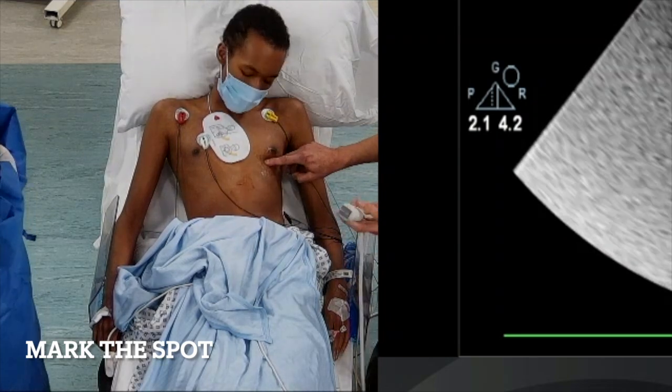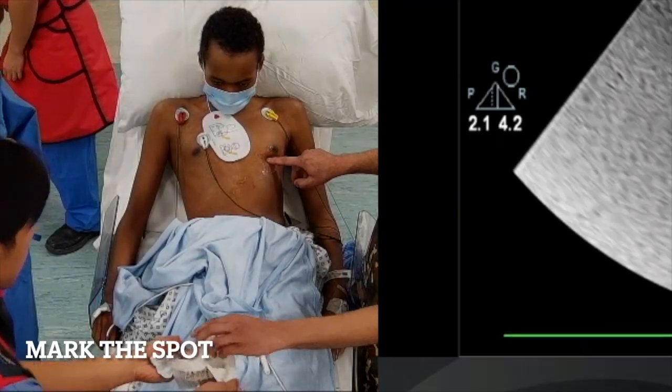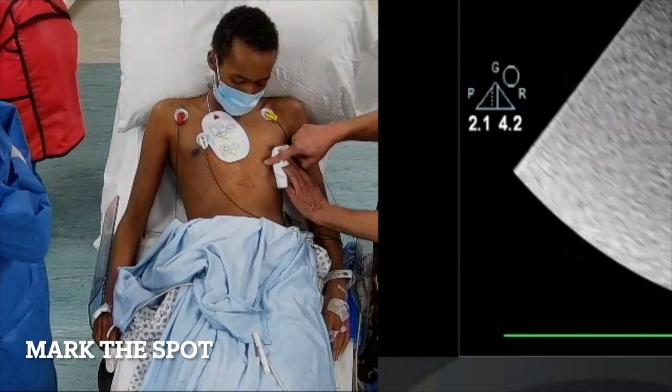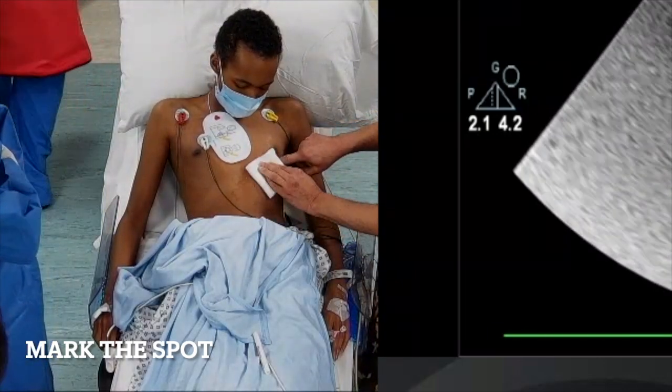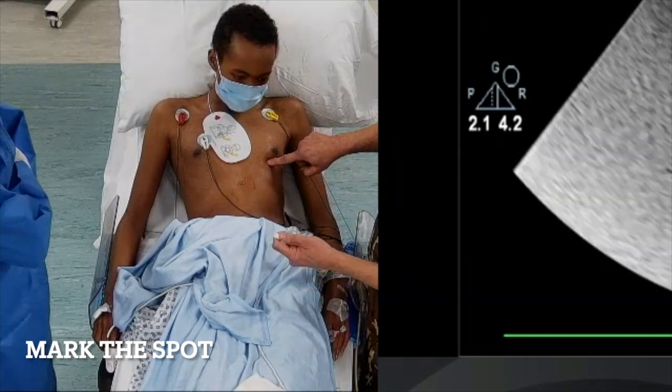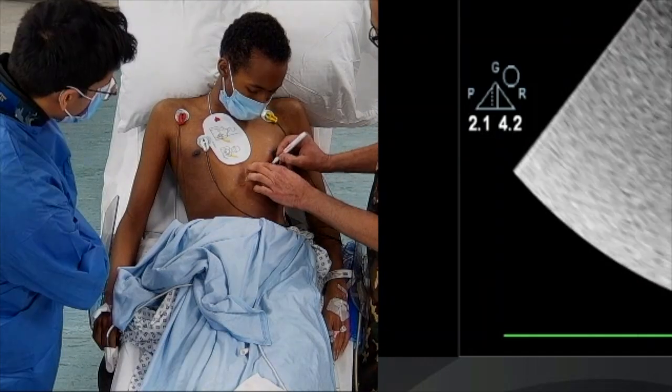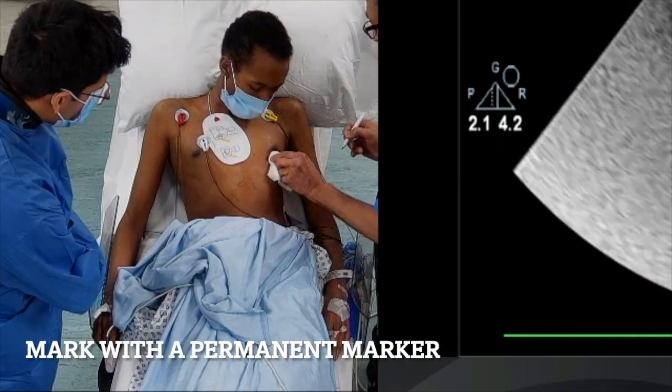I've marked the spot with my finger because the ultrasound is now away. I wipe away the gel and use a marker to position exactly where I am. I'm aiming to be just above a rib where there is no blood vessel or nerve — not just below a rib where there is a neurovascular bundle.